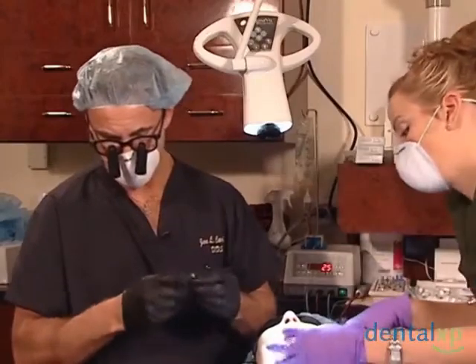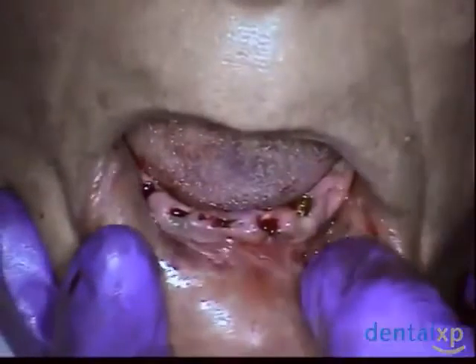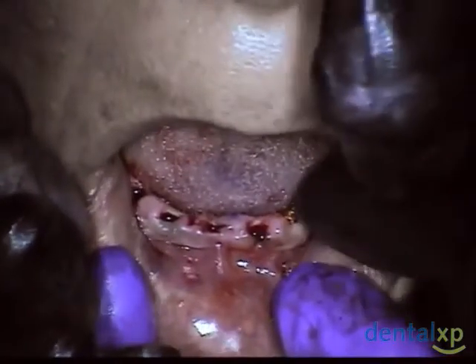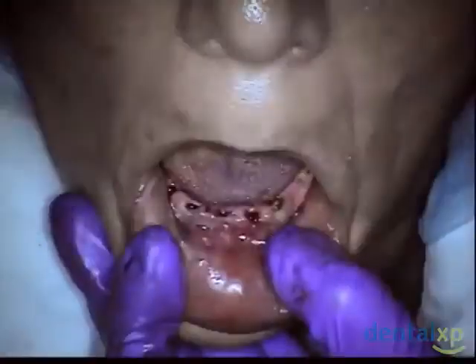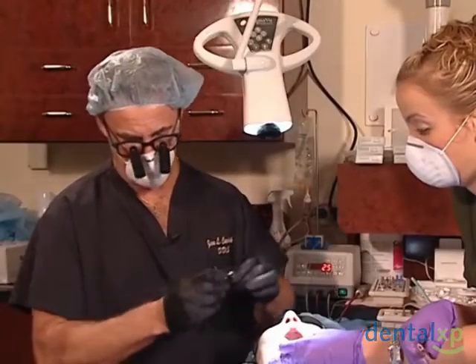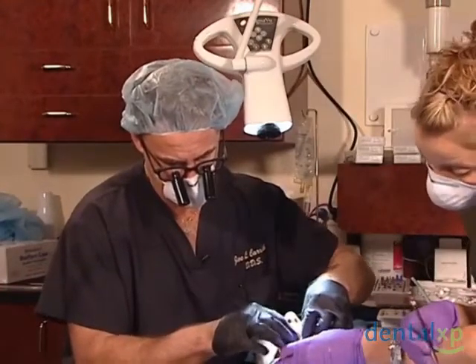For those that haven't used the system, the arrows tell you where to go. And we want to arrow away. That means we're going to remove it and go back in and tap that area. Not tap it, but tap that cortical plate of bone. And with this, you want to make sure that this hex seats on that abutment. If it doesn't, then you need to reposition it till you feel it fall down over the abutment. And when you feel that, just like we did with a driver on the hand, you see now it's seated.